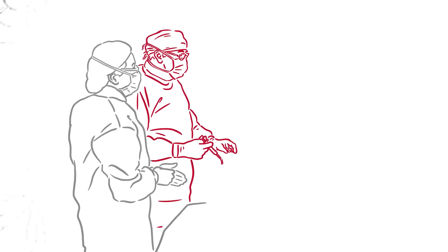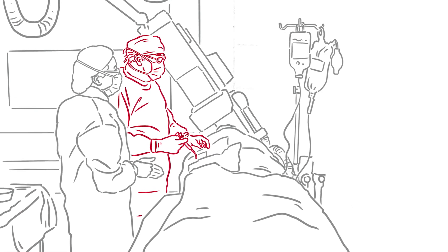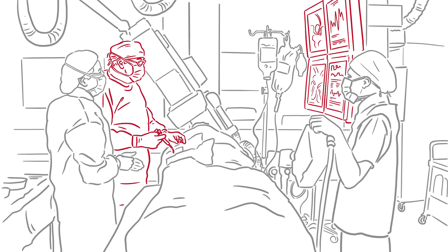Experienced operators report that it takes a few procedures to gain procedural confidence and understand its key differentiators.